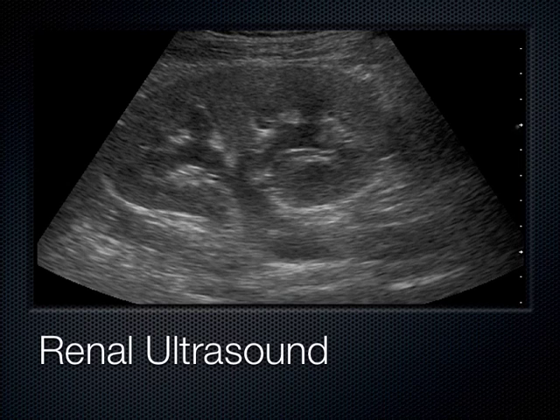For example, when the urine tries to make its way out the ureter, if the ureter is obstructed by a kidney stone, the kidney can't really expand, and that's what causes such terrible colicky pain. So that thick capsule is out here. This is the cortex of the kidney, and we can see the cortex all the way around here. And this is the sinus or pelvis of the kidney, this hypoechoic or anechoic area. Recall that hyperechoic means bright, hypoechoic means dark, and anechoic means black.